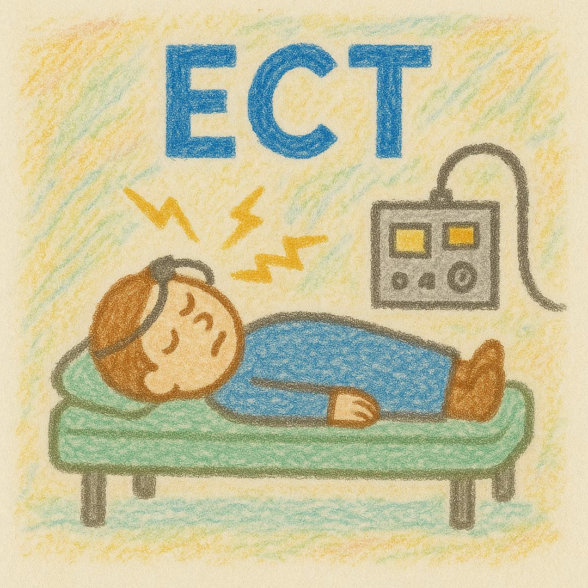The other thing you're going to be doing in that consultation is obtaining informed consent. So let's say you've established they have an ECT responsive condition, their medical risk appears to be pretty low, they don't have any major cardiopulmonary problems. Then you're going to be telling them about ECT and what it entails and the risks, benefits, alternatives, and prognosis. So you're going to be getting informed consent there. So those are the main three components of doing an ECT consultation.